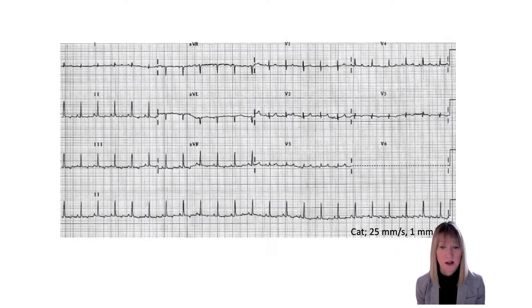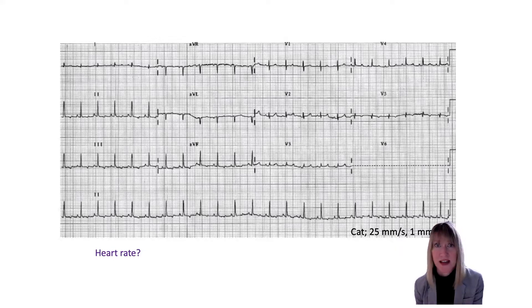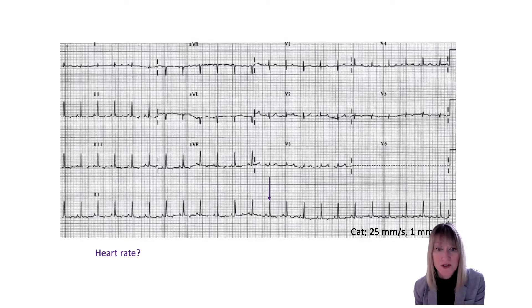The first step we're going to talk about is coming back to heart rate again, because that sets the tone for whether I'm dealing with a rhythm diagnosis that falls within the normal heart rate category, or something that's making the heart rate go too slow or too fast. So I'm going to pick a heartbeat for this cat ECG. We see here that the paper speed is 25 millimeters per second. For our feline friend, I'm picking on this one complex that I've identified with an arrow, because it lines up with one of those dark grid lines, and I'm going to use the 300 rule. So I'm going to count over to where my next heartbeat intersects the grid.